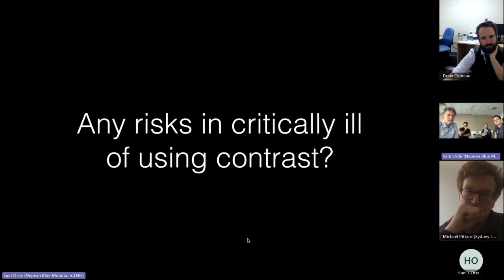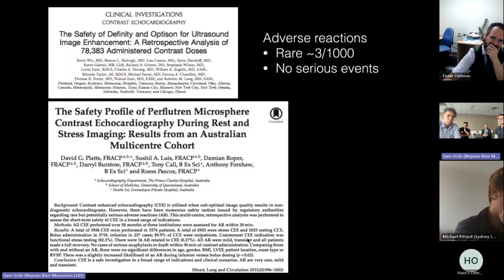So is it safe? This I think is probably the big question that was about maybe 10 years ago now. Contrast has been around since, I think, the 1990s, could be even earlier. It originally came out with a big black box warning that you couldn't use it in patients that had pulmonary hypertension, who had holes in their heart, which is potentially still true, and if patients were cardiovascularly unstable. I think we've got pretty good evidence now to talk about the safety profile.